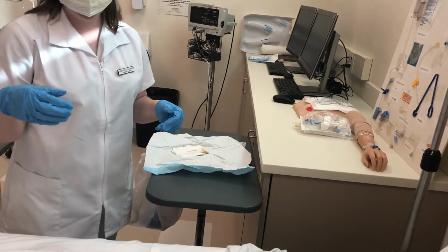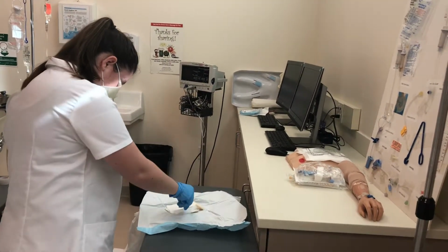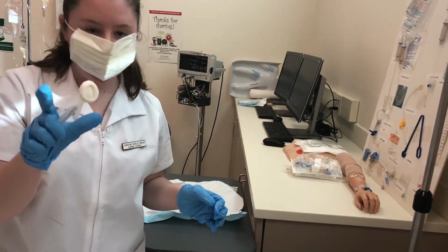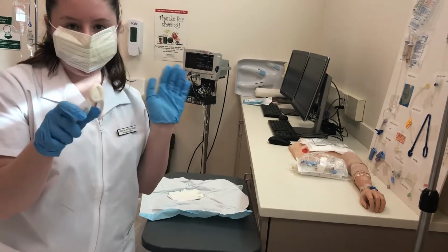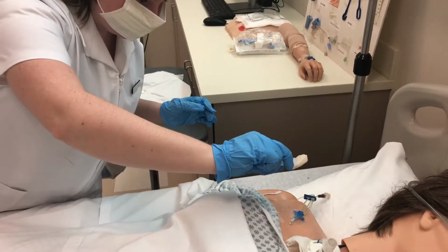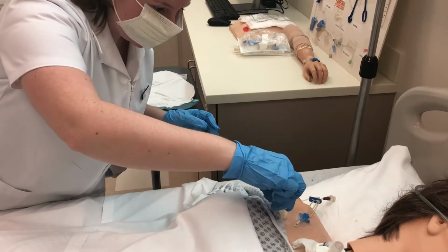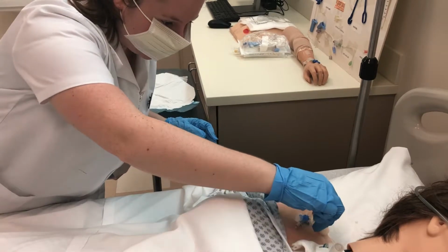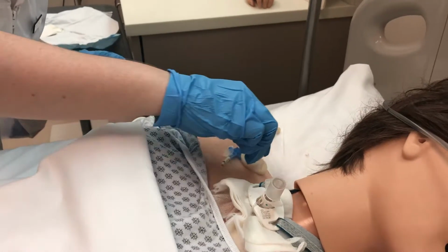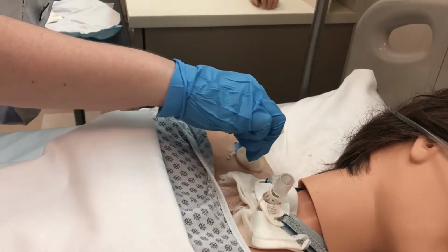So I'm going to let that set for a little bit and then I'm going to get my ChloraPrep applicator. So now I have my ChloraPrep applicator. I'm going to click this to activate all the cleansing. And I'm going to make sure I'm creating friction, going in horizontal and vertical lines around the site, not creating friction where I'm hurting the patient, but enough friction where I'm cleaning the site and making sure that everything is taken care of.